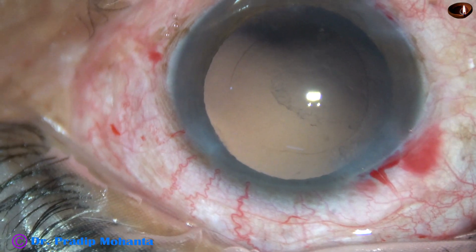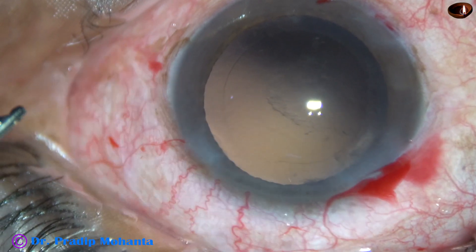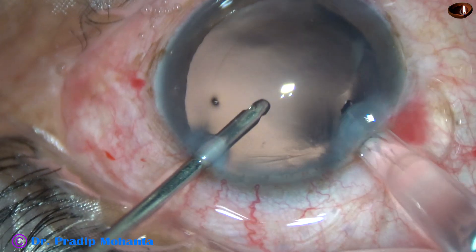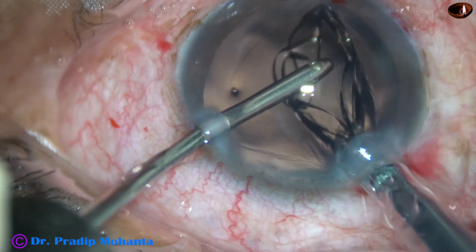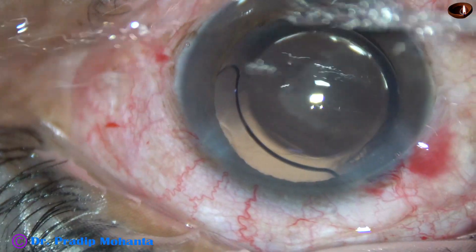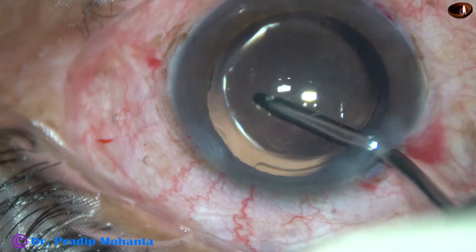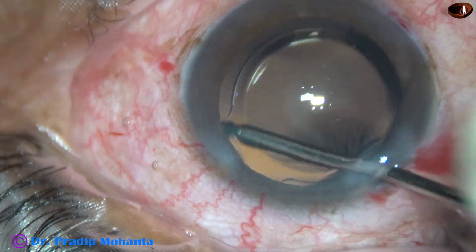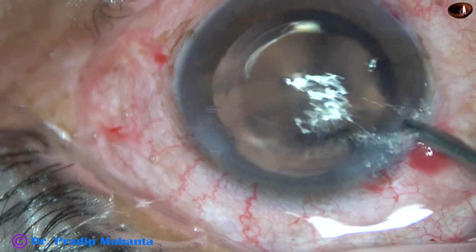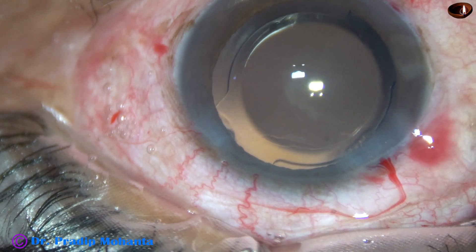A little bit of fibrous plaque is there at the central part — it is better not to do anything about it. This is hydro-implantation of a single-piece monofocal intraocular lens, and the lens goes into the capsular bag. If there is a thin fibrous plaque, it is better not to do anything. The patient will get about 6/9 vision with this plaque, and we can always remove it by YAG laser later on.